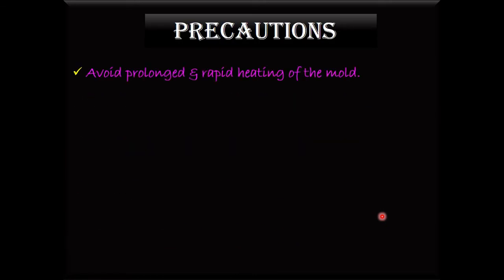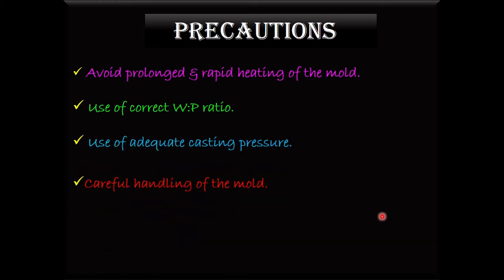So what precautions do we have to follow? Avoid prolonged and rapid heating of the mold, use the correct water powder ratio, use adequate casting pressure, and handle the mold carefully.